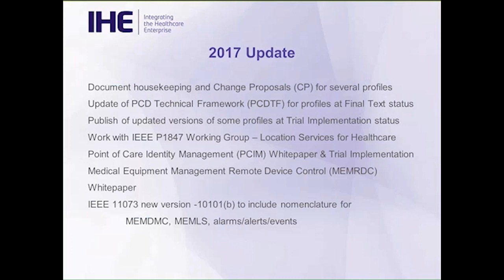This is where it's been verified across all actors, transactions, for a couple of IHE PCD connectathons, and you have a stable profile that others can develop to in large numbers. But we also have a few that are at trial implementation status, and that's good for testing out vendor implementations and for connectathons.